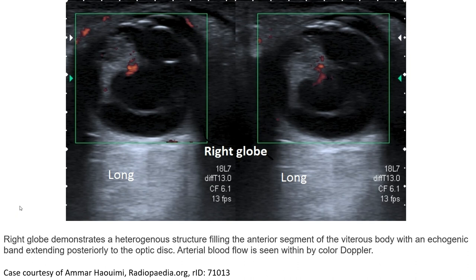This is a second ultrasound case of the eye representing PHPV, where the image shows a heterogeneous structure filling the anterior segment of the vitreous body with an echogenic band extending posterior to the optic nerve. Arterial blood flow is seen within the stalk on Doppler.